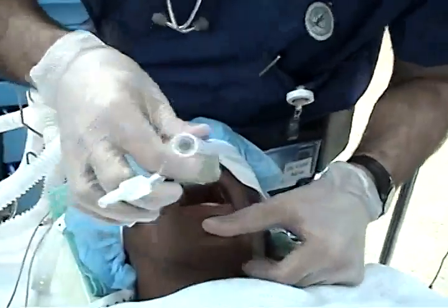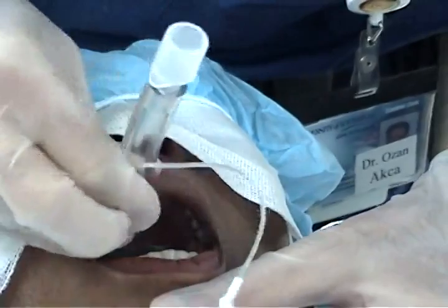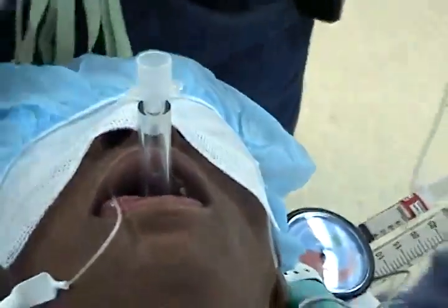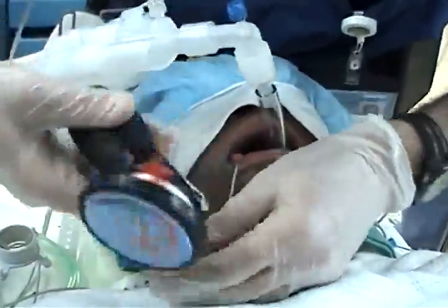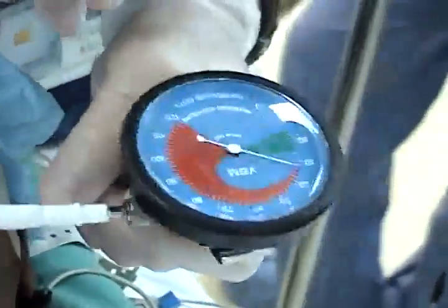You will feel a pop as the Cobra PLA head turns into the hypopharynx at the back of the mouth. Insert further until moderate resistance to passage is felt, and then pull back slightly. Inflate the cuff to no more than 60 centimeters of water. Refer to the Cobra PLA tube for cuff inflation volumes.